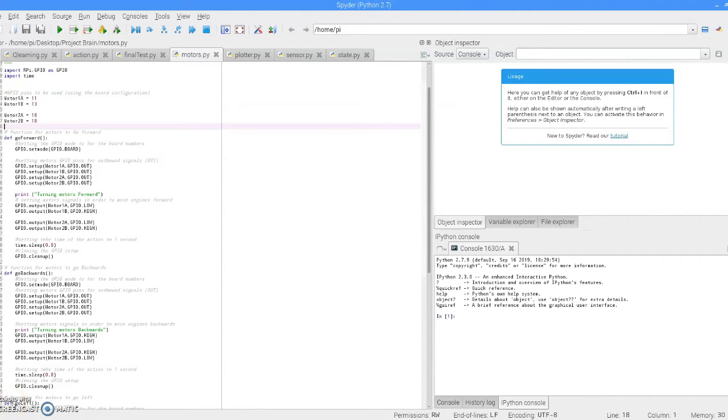The motors file is where all the functions for the mobility of the device are created. The way the functions are created is to first set the GPIO mode to GPIO board for the board numbers. Then we set the GPIO pins for outbound signals, and then we set the way these signals are sent in order to move the motor in a certain direction. Each action has a time frame. In this example, the action of going forward is set for a time of 0.8 seconds. After this action is completed, the GPIO setup will be cleaned up.